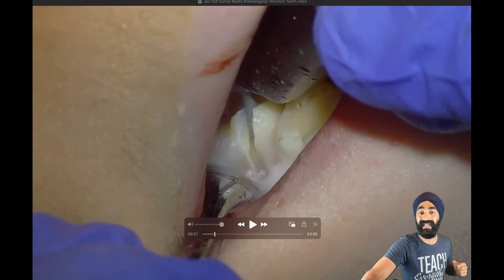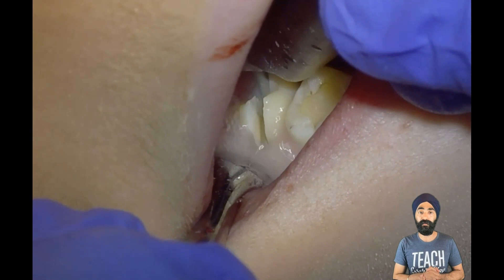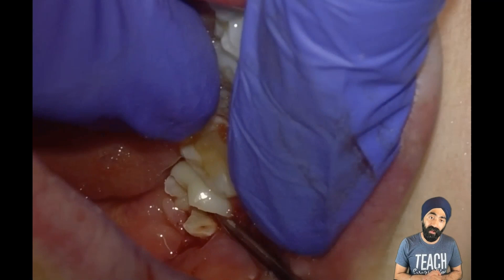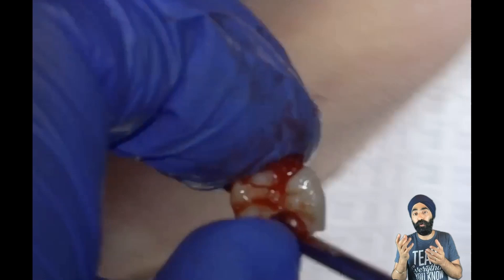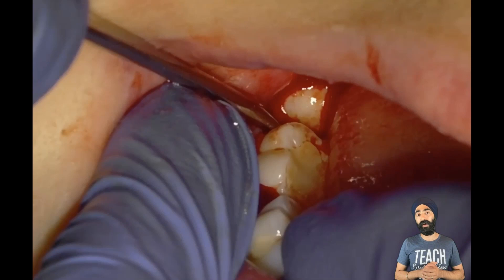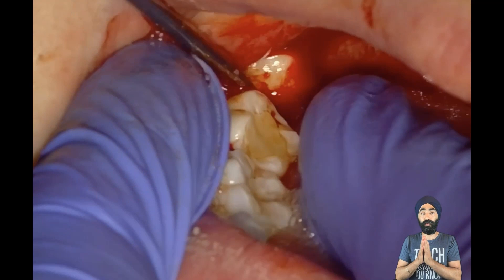So I'm sectioning, angled as described. Once I get most of the way through, I'm not going all the way through the lingual so I don't risk damaging any lingual nerve. The crown comes away — that easily is usually a sign the crown has broken away, which it had, and I wasn't able to get the root out. I do some elevation and luxation now to try and get it loose. That's the mesial handle — you want to preserve that, which is why I did the section distally.